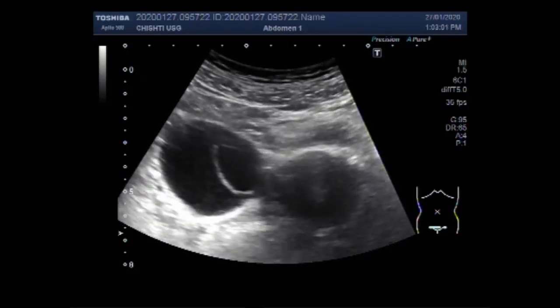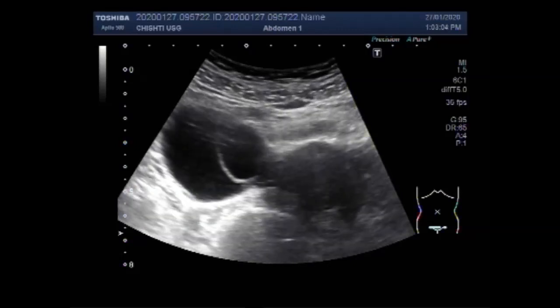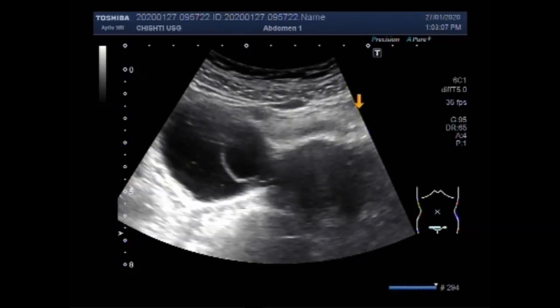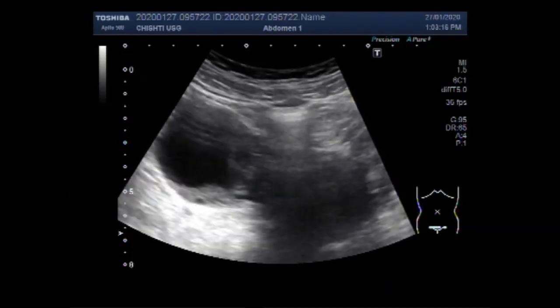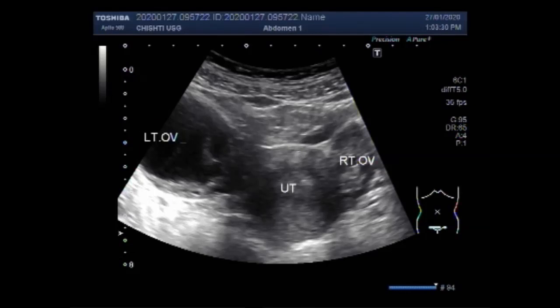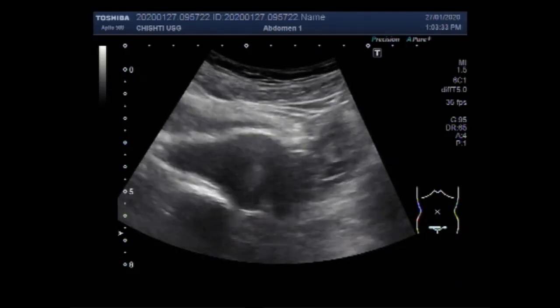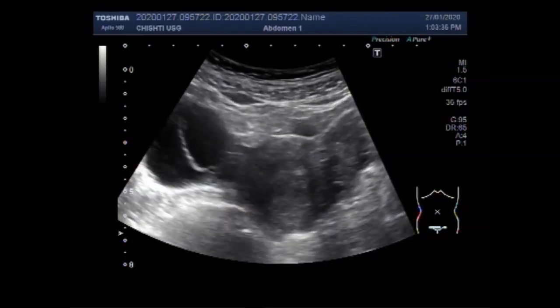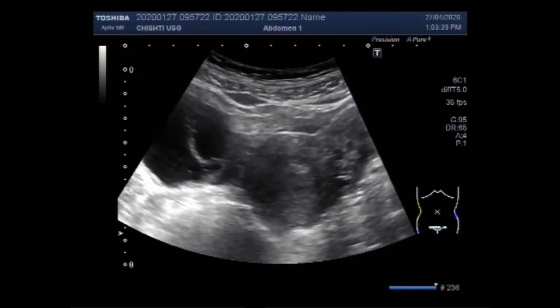Again, you can see the mass in the distal portion of the uterus. You can also see a left ovarian cyst, and a small daughter cyst is seen within this larger cyst. This is the uterus and this is the left ovarian cyst. So this is a uterine mass — fibroid — and a left ovarian cyst.